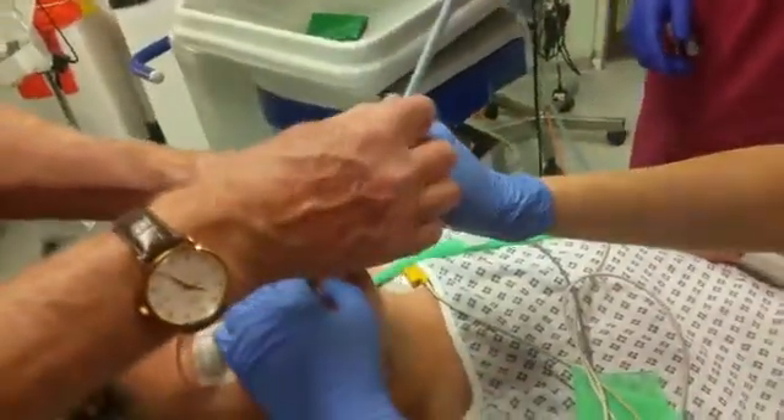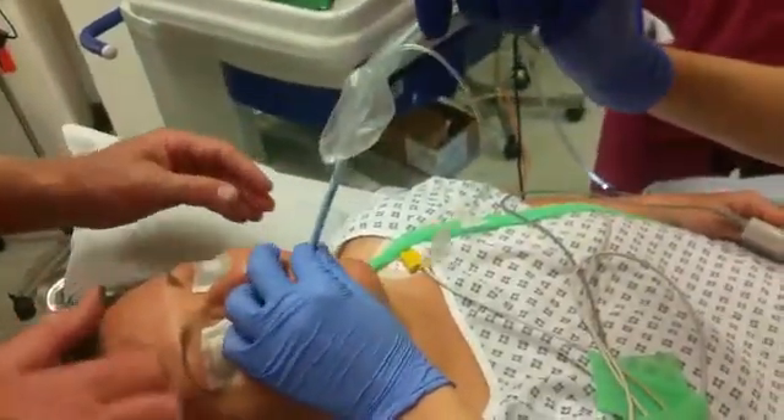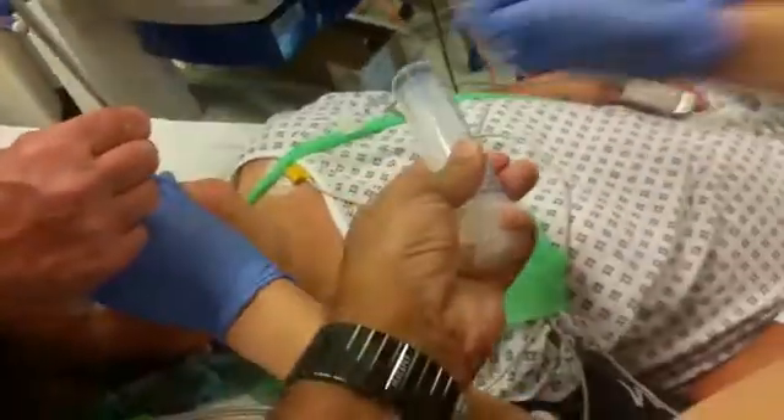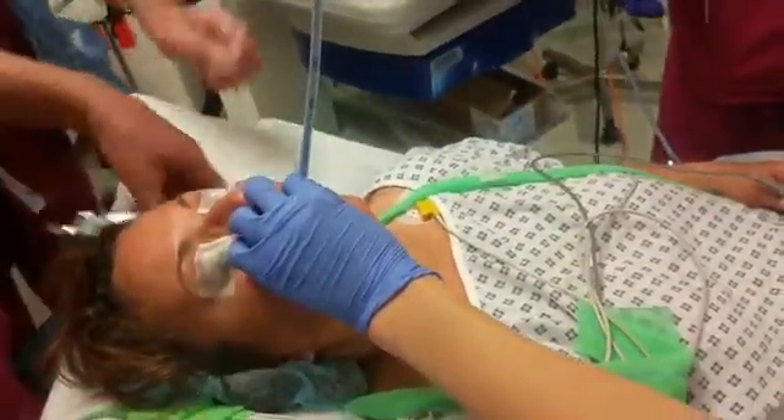There's one just upcoming you there. If you adjust that back to about... It's a 25 at the mouth. Okay, so down third to... That's 25 at the teeth there. Let's go.